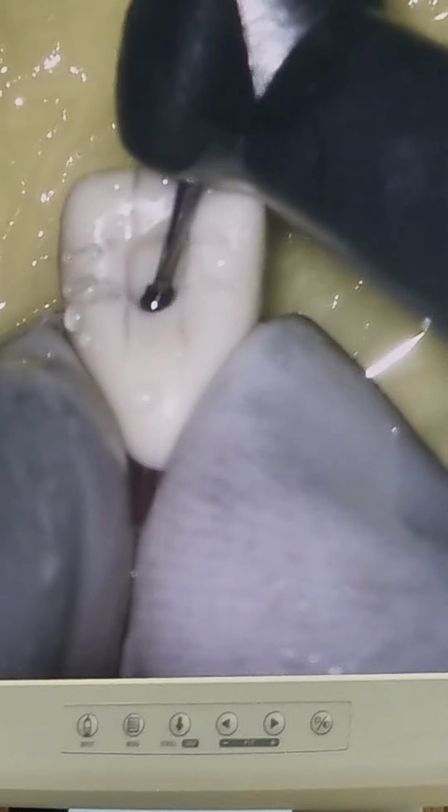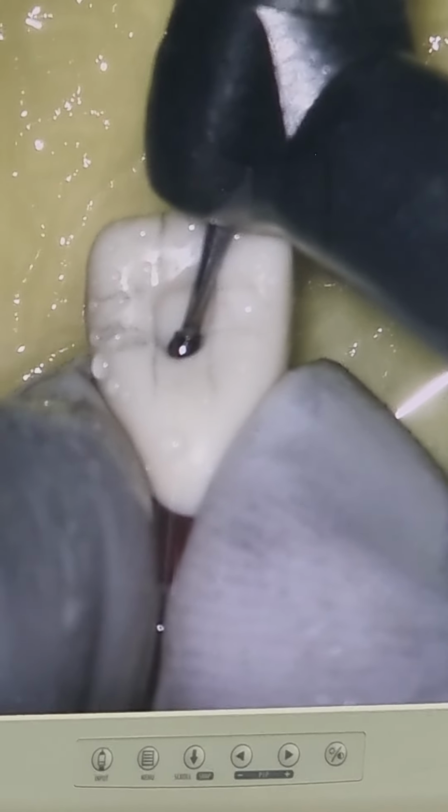The moment you reach the pulp, what will happen? Enamel is hard, dentine is hard, pulp is soft. So enamel will give you resistance, dentine will give you resistance, but pulp will not. So the moment I reach the pulp chamber roof, what will happen to the bur? It will drop. We call it the drop-in effect. Drop-in effect means the bur from the dentine has now entered the pulp chamber.